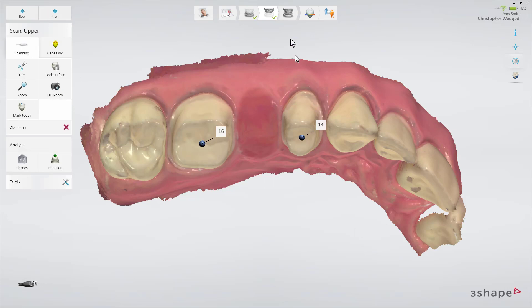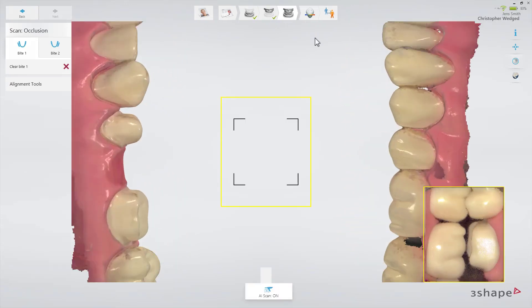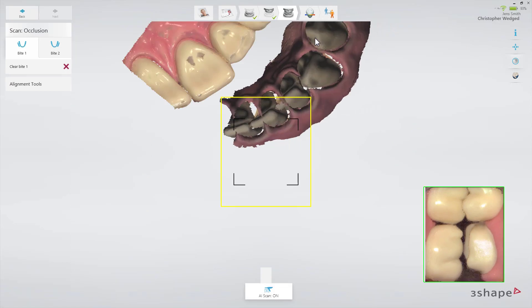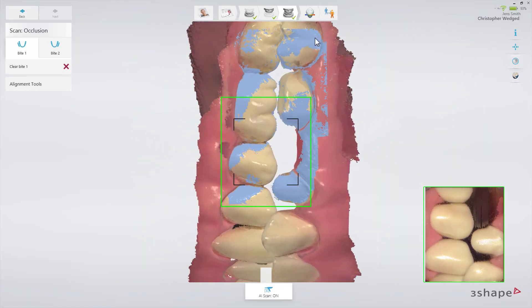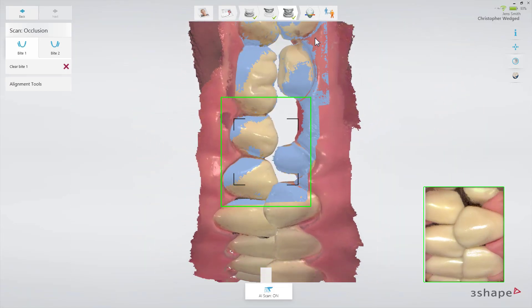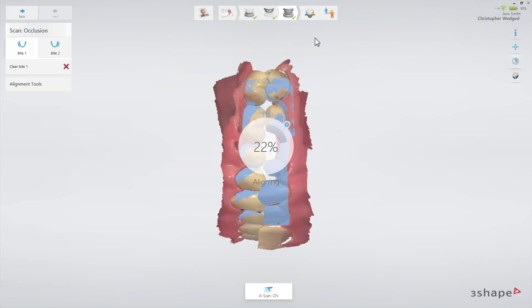Now move to the bite scan page. Insert the scan tip to the second molar on the buccal side. Ask the patient to bite. Scan three or four teeth until the upper and lower arches snap to the bite scan. The light blue surface indicates the surface covered by the bite scan.